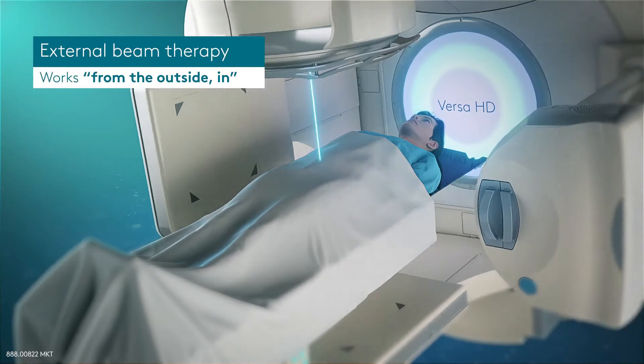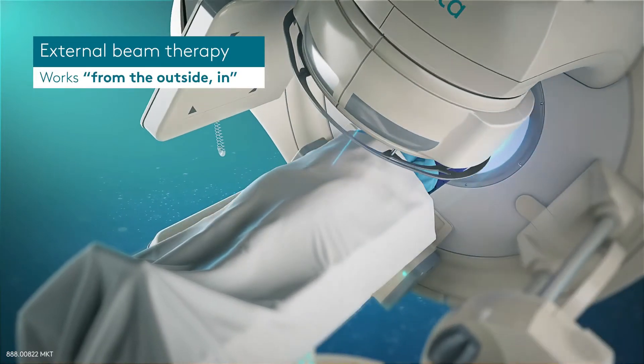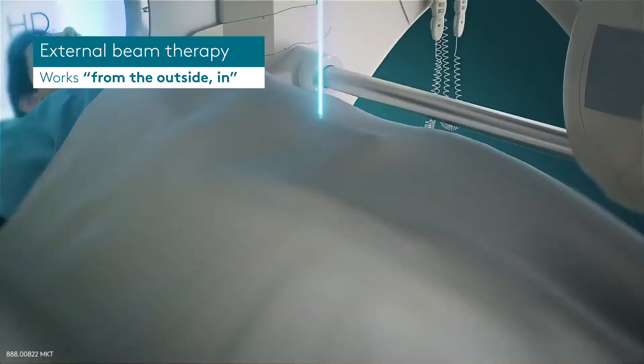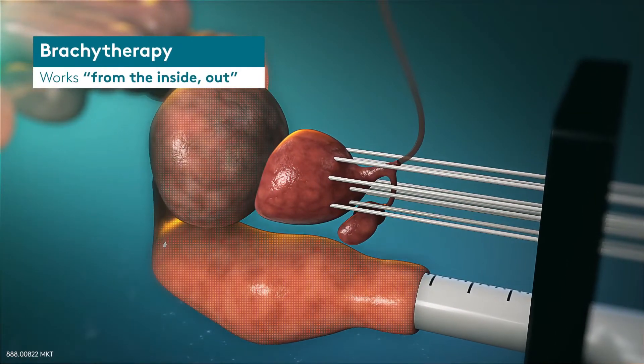Hi. Welcome to another Biomedical Engineers TV video. We will be starting a series on nuclear medicine instruments. In this video, we look into brachytherapy.